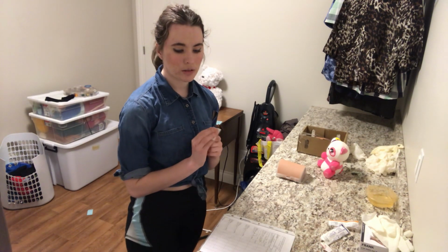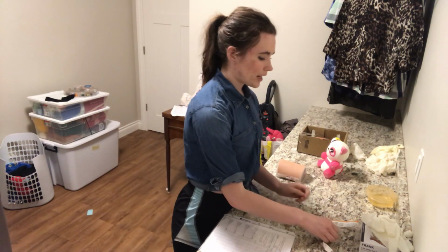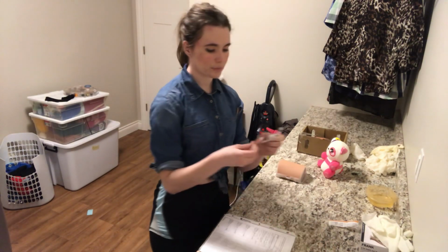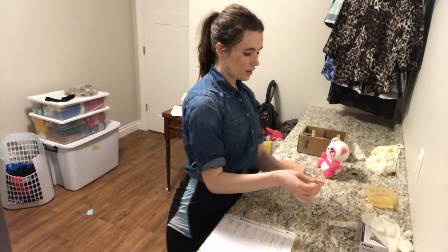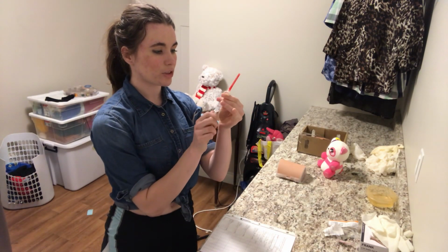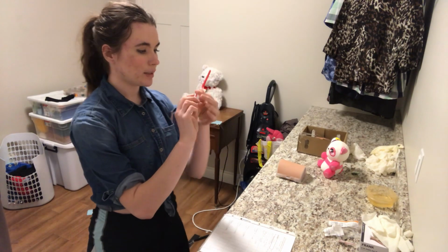So now I'm going to take my vial, and I've opened it, and I'm going to wash it in a circular motion with an alcohol swab for 30 seconds, and it's been 30 seconds. So now I'm going to take my 3 ml syringe and my blunt fill needle, peel back in a butterfly formation, and I'm going to connect them without contaminating the hubs, just like so. Now I'm going to move the plunger back and forth without contaminating the plunger itself, just to make sure there's no resistance. And I'm going back to 1/2 ml there.